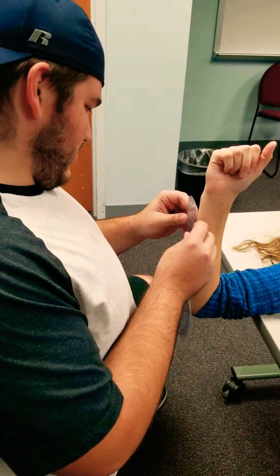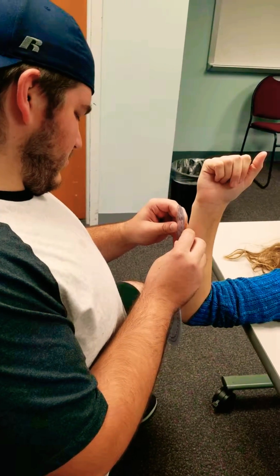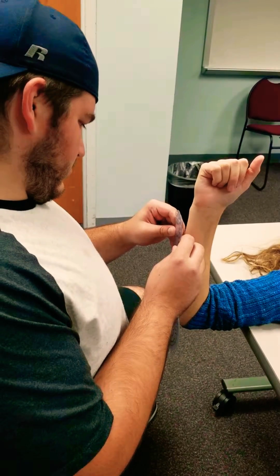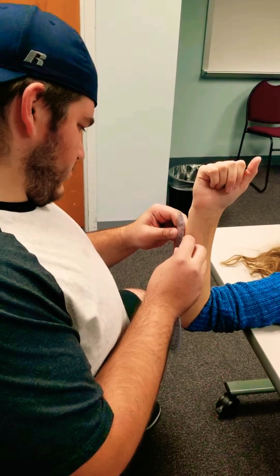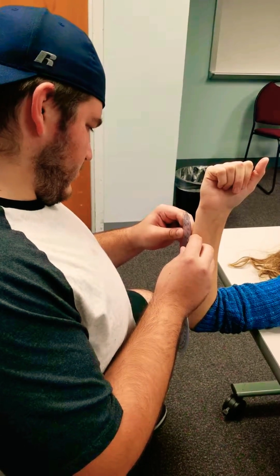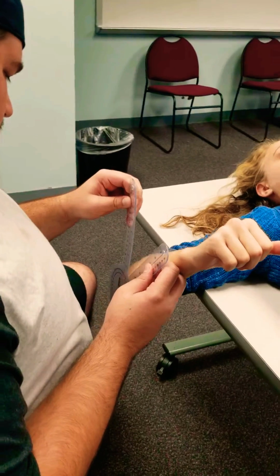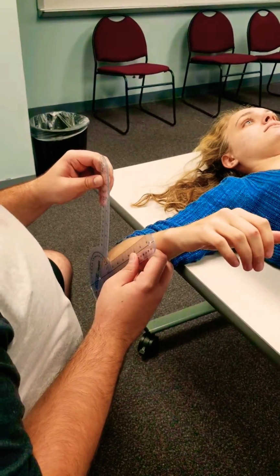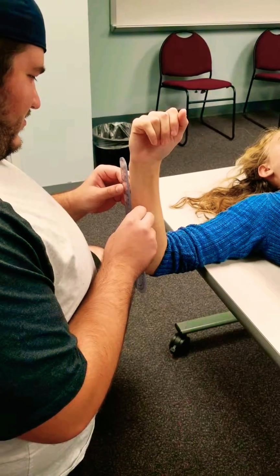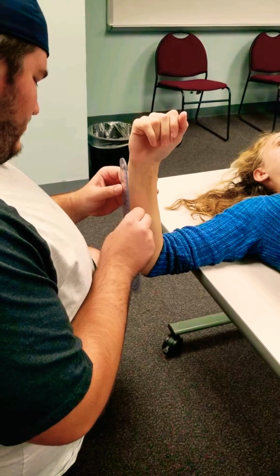And the landmarks that we are going to use for the center is going to be at the olecranon process. The stationary arm is going to be perpendicular to the floor, and the movement arm is going to be in line with the ulna and uses the ulnar styloid process as a reference point. The first range of motion we're going to measure is active range of motion. The next movement that we are going to measure is passive range of motion for internal rotation.